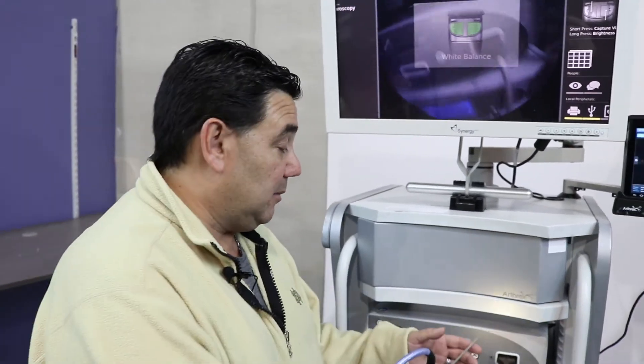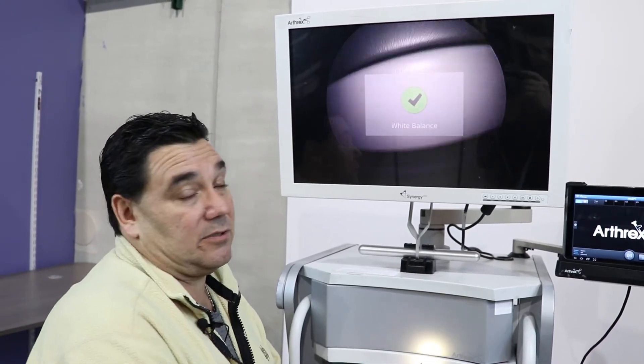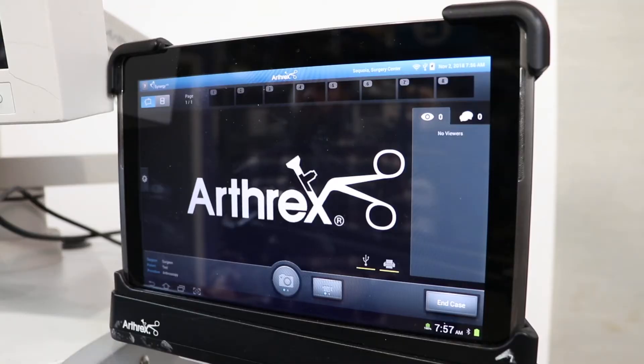The system is asking you to white balance the camera system. So basically you would use a cloth, but for this demonstration purposes, we're going to use the white on the actual video card itself. Now we're ready to go and start the procedure.